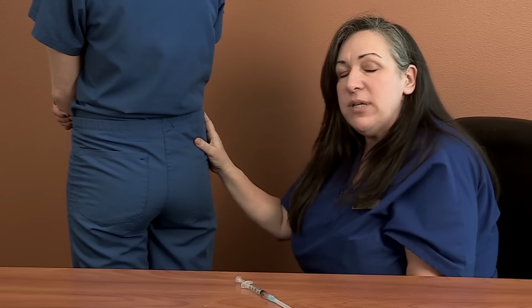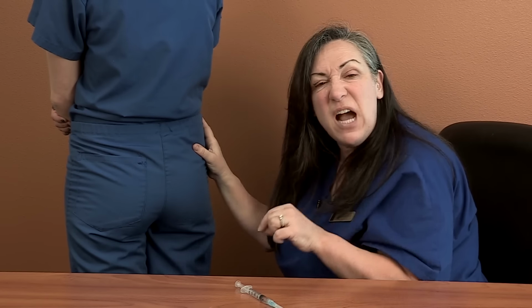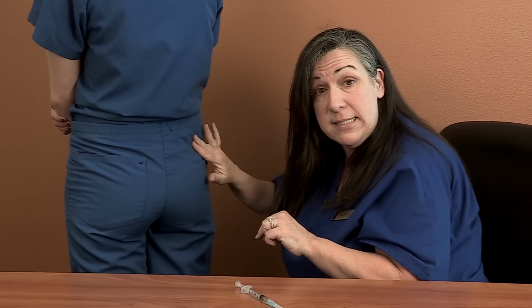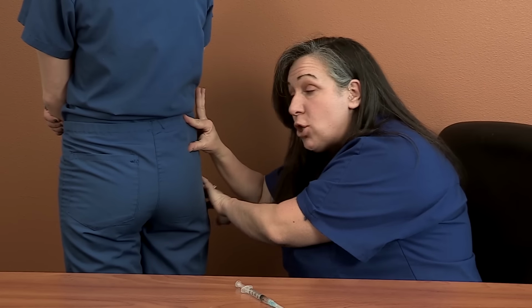Now, this injection is literally the opposite of what we've been doing. We've been pinching up tissue because I'm trying to get the medication in the fat. This is an intramuscular injection, so I'm trying to get medication in the muscle. So I'm going to do the opposite here. Of course, I'm going to get a little alcohol swab and clean the skin here. But instead of pinching up, I'm going to press down and make that taut. I'm trying to flatten out any fat she has right there.